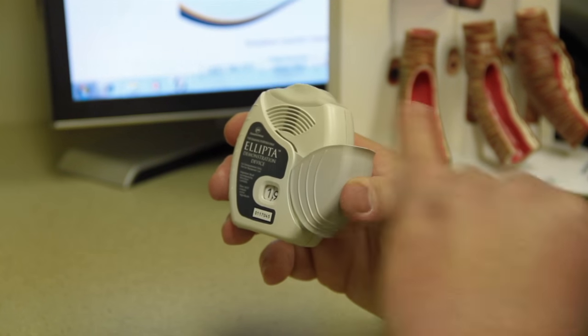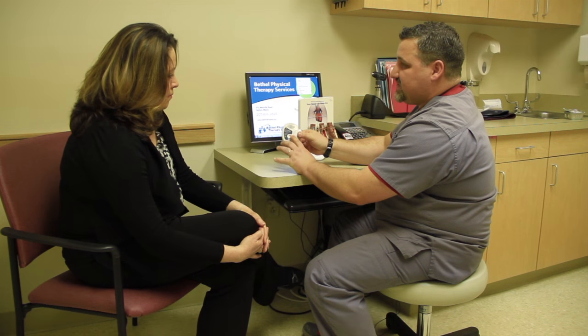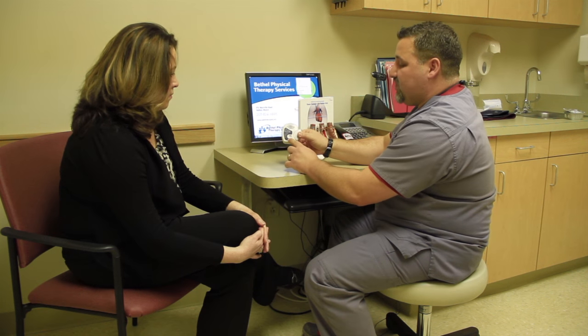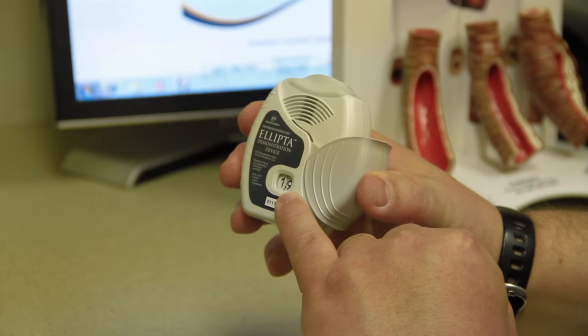Once the dose is loaded, there is a window on the front, and this shows you how many doses are left in the inhaler. Every time you open the lid to take a dose and load it, this will reduce by one.